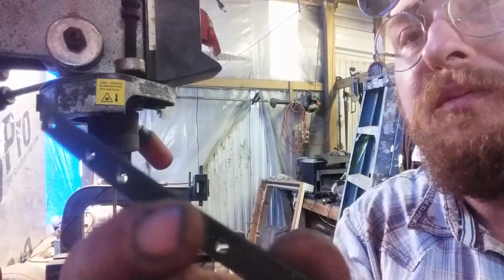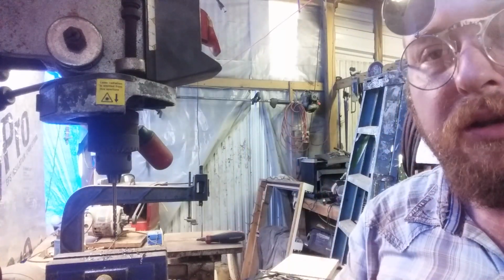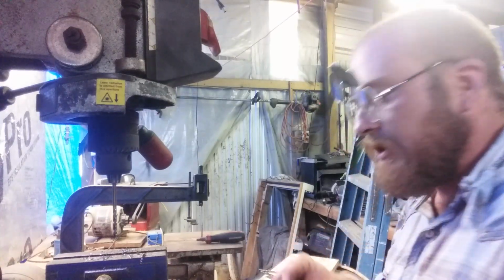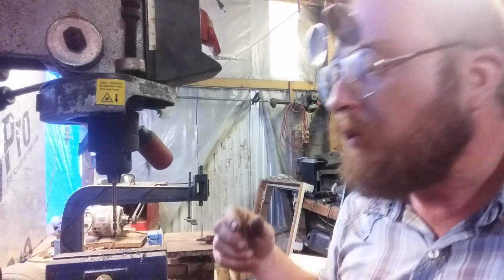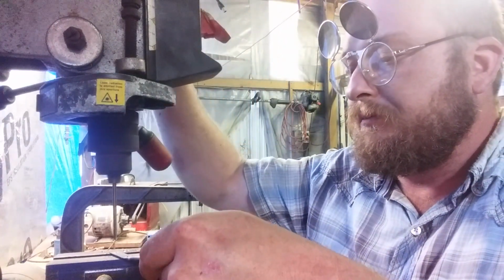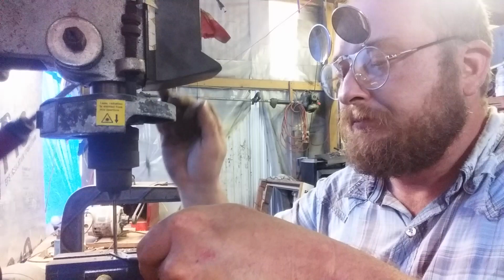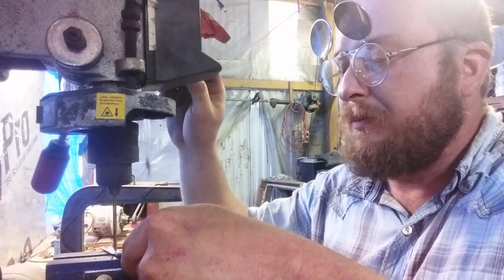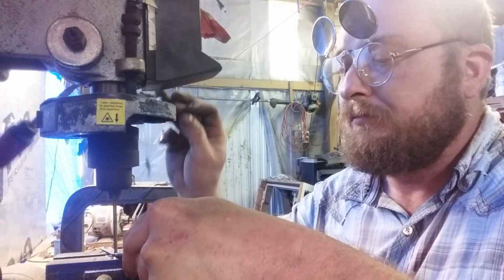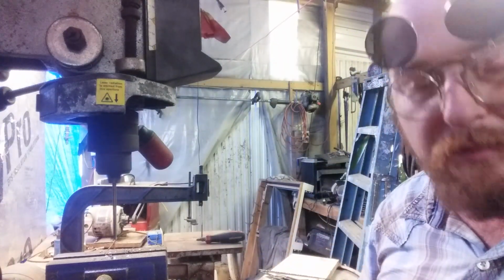That did all right as far as the burring on the back. I'm going to just run that lightly over the little belt grinder, and I'll let you see me drill out one of these, and no point in you watching me drill the whole thing. Go a little easier and it does a little better. I want to drill another one.